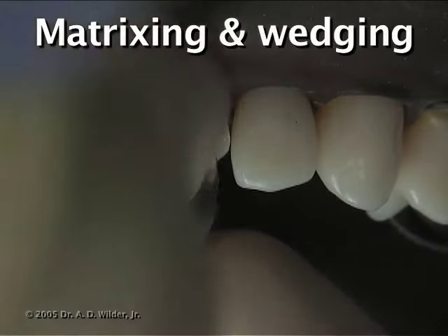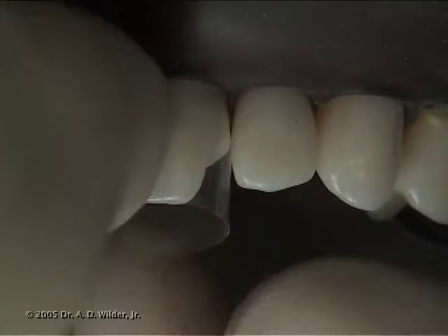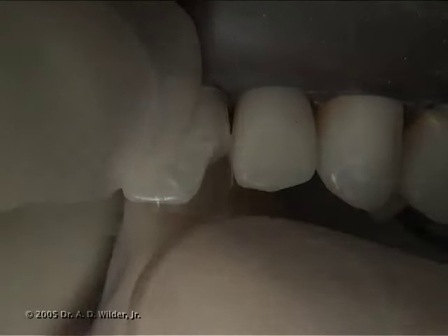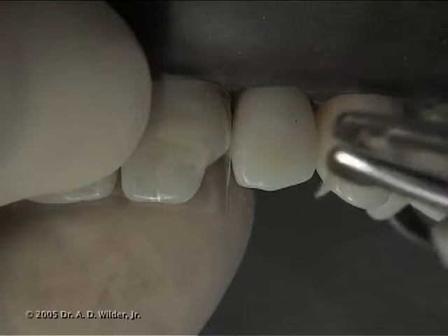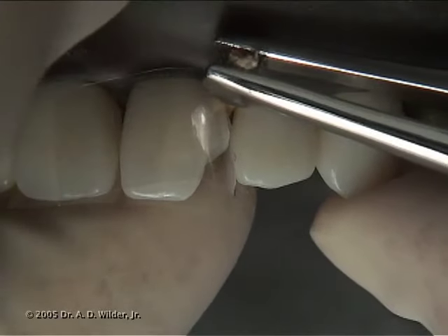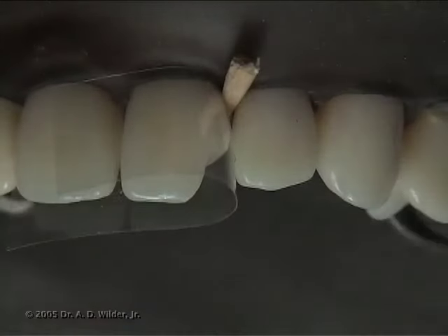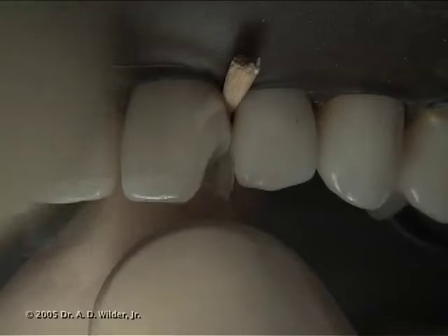Place a rounded, contoured matrix strip in the contact area and hold it in position with two fingers while placing a wedge underneath the preparation between the matrix and the adjacent tooth. A properly placed wedge prevents gingival overhang and open contacts.